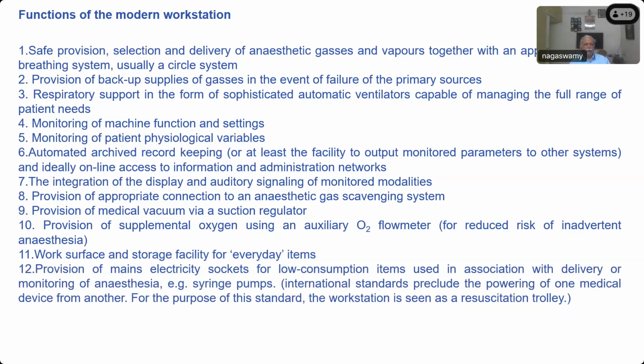And there are work surface and storage facility for everyday items, and provision of mains electricity sockets for low consumption items, and the association with delivery devices like syringe pumps and other things. Okay, so these are the various modern functions of the workstation. If you remember at least half of it, then it will be good enough. If the examiner asks you what are all the advancements or the improvements made over the basic Boyle's machine. Similarly, there is a basic design.